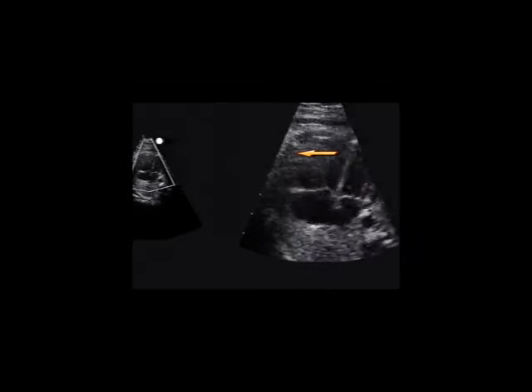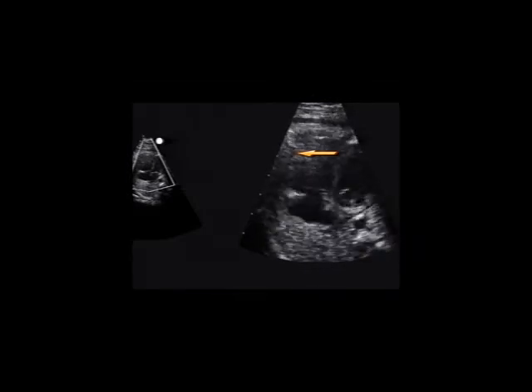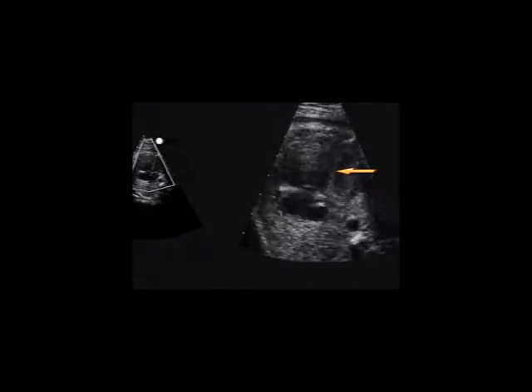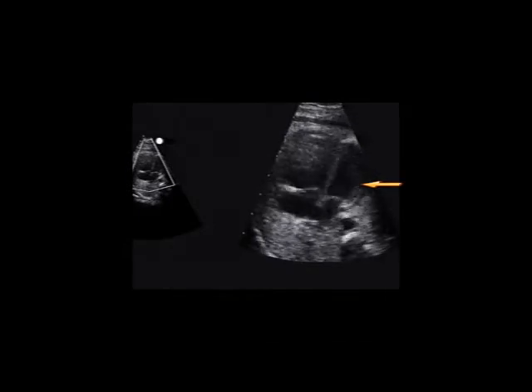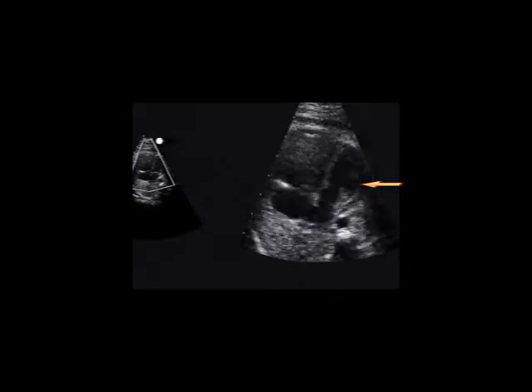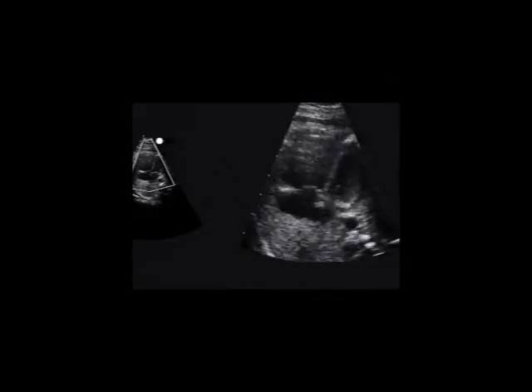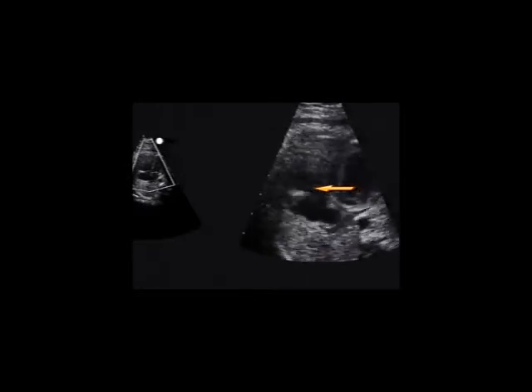В режиме двухмерной визуализации определяется значительное расширение правых отделов. Амплитуда движения задней стенки правого желудочка значительно снижена. В то же время определяется гиперкинезия межжелудочковой перегородки и задней стенки левого желудочка.